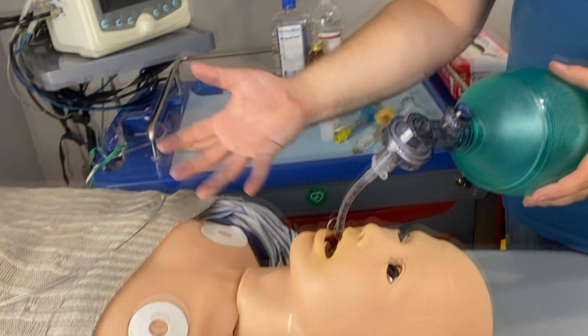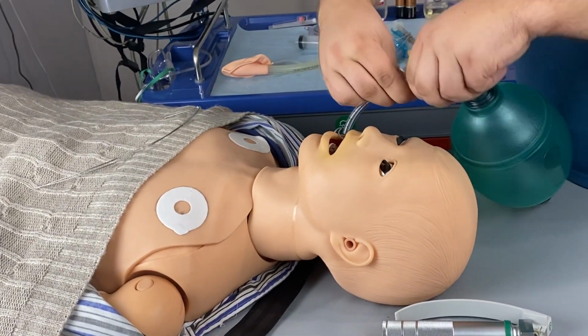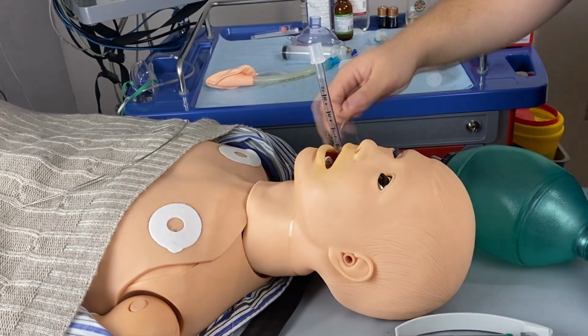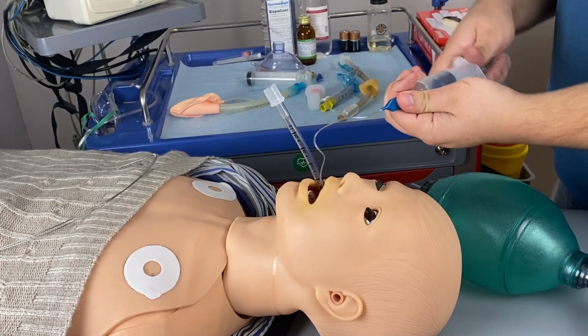Now, in this case, we do need the verification because this manipulation requires precision. So if you miss, if you get in the esophagus and not in the lungs, you will not get any respiration, and you will just ventilate the stomach. Of course, it's not good for the patient. That's why we do have to check. Actually, we have to check every time, but now it's even more vital than usual.